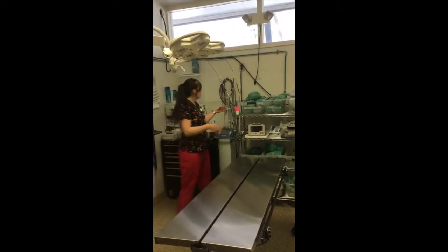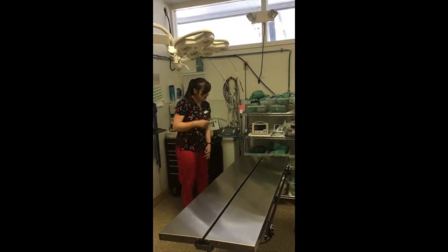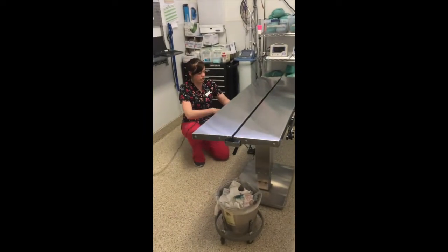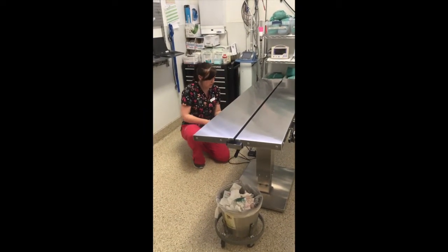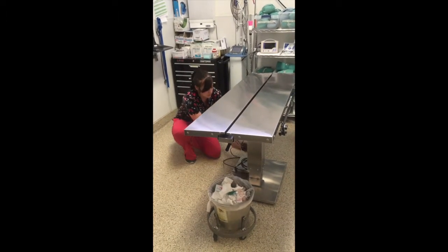Those are all out of the way. We want to go ahead and unplug our surgery table. Our surgery table is heated, so I'm just unplugging it so the heat doesn't stay on. I'm going to wrap the cords up so they don't get tripped over or broken. We place those down beneath the table along with the pedal.